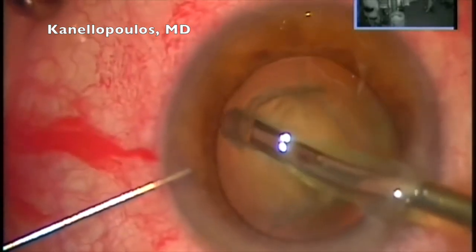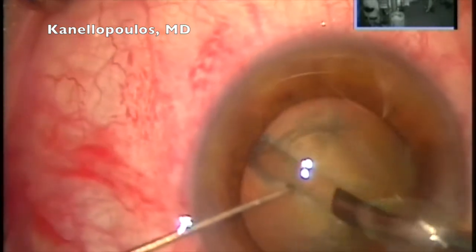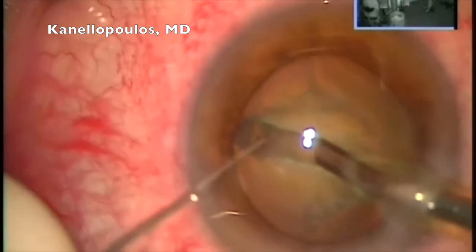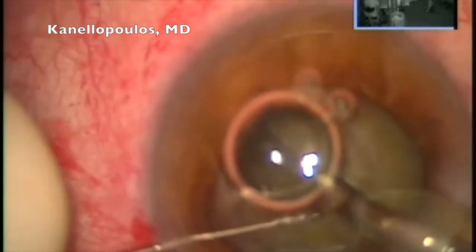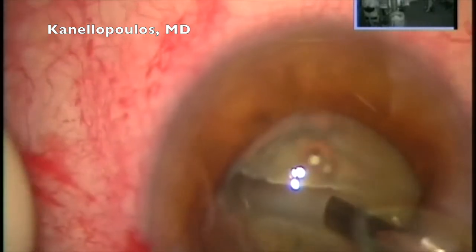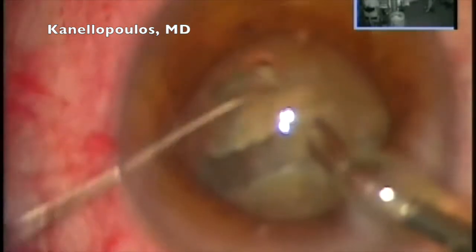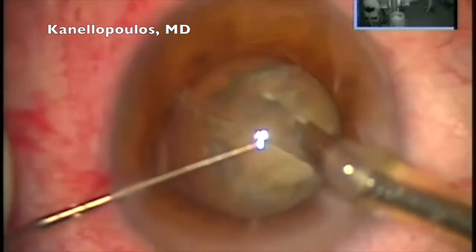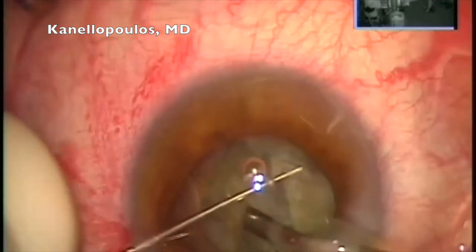Here's our phaco tip going in and emulsifying the lens. We're going to use a divide and conquer technique, and here we can see this is a significant cataract. I'm very careful not to push and stress the zonules. I'm going to use my second instrument to stabilize the lens. I'm going to have a little bit of iris trapped in my paracentesis — always keep our eyes on the whole picture. We're up with energy at 60%, and we're rotating the lens. Fortunately, the lens rotates well.